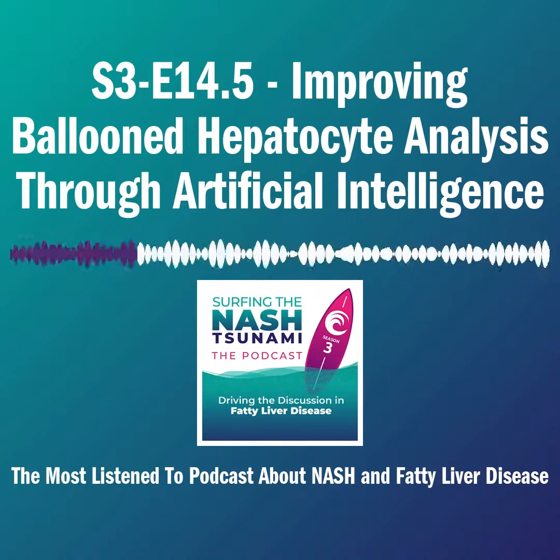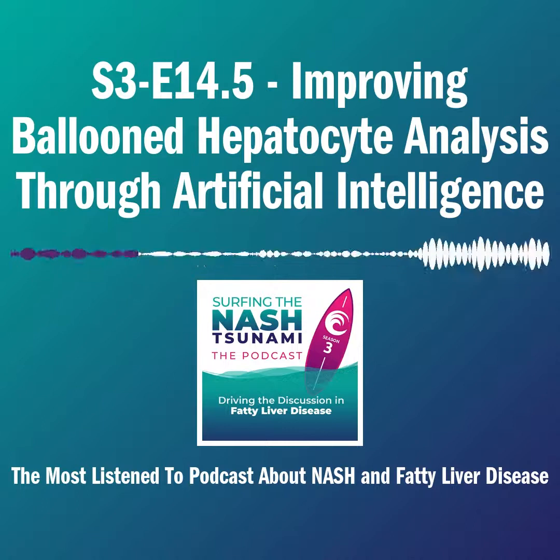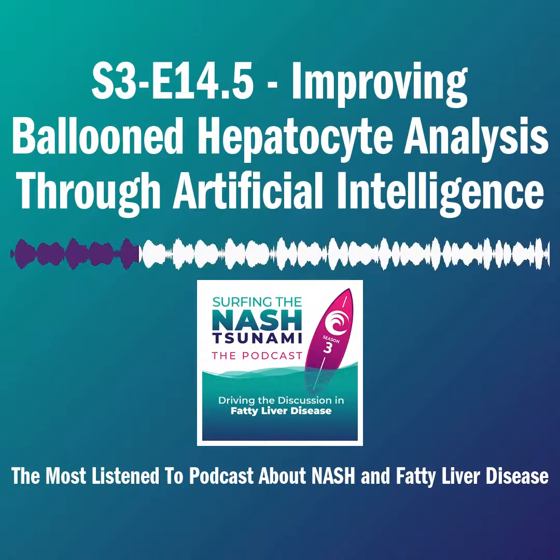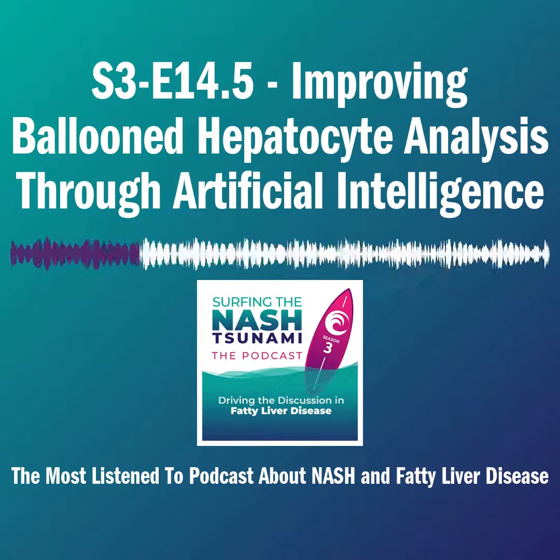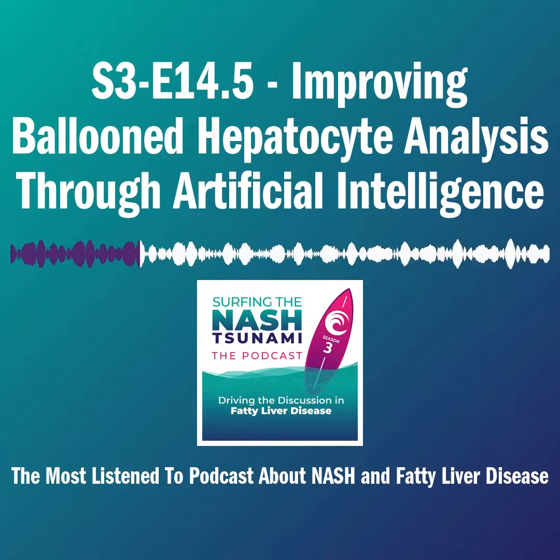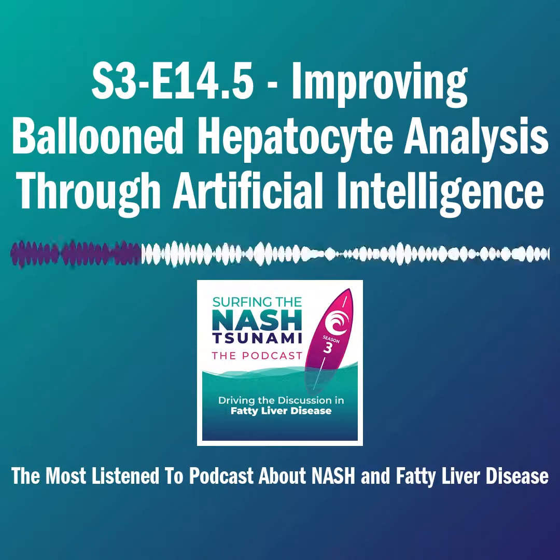First of all, I'm just explaining what the data is showing. So there are what we call basically overcallers and undercallers. There are people who continuously overcall a lot more than others. But at the same time, they are self-consistent. That means when we rotate the image, they still call it the same way. So I think that means they have a level of threshold internally.